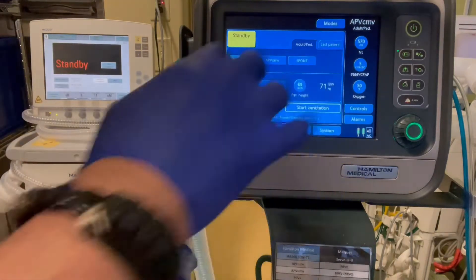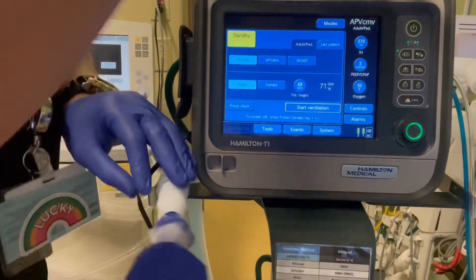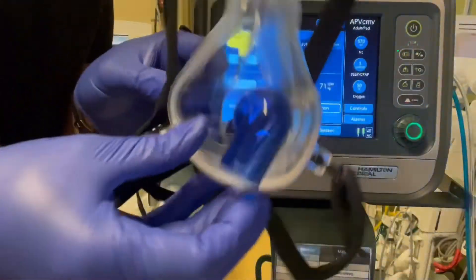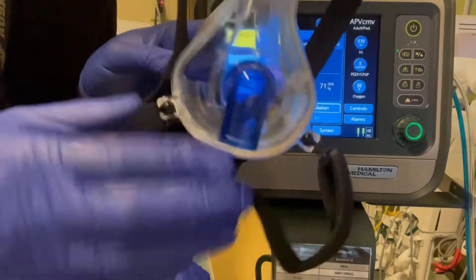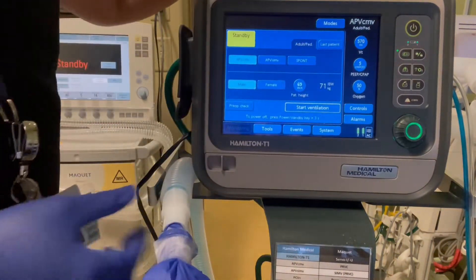Ventilator. The first thing we're going to do is set a patient up. We actually have a patient on a test lung here, but in reality we're going to have him on a mask — a non-vented mask. You see we've had the blue elbow, showing that there's no holes in the mask. The exhalation is going to be in the circuit.